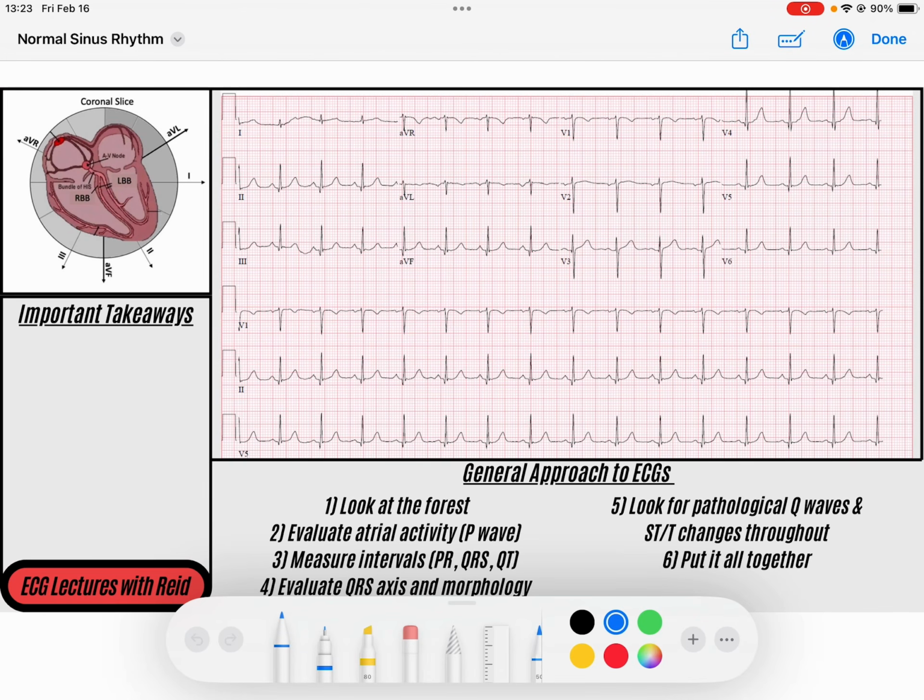Hey everybody, welcome back. So today, my goal with this video is to talk about the normal sinus rhythm and to talk about my approach to the ECG and apply that to a case of normal sinus rhythm.